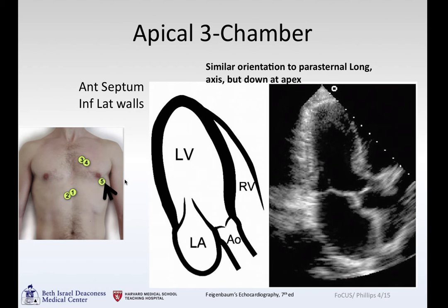Rotating even further — all of this, by the way, is done with the patient in the left lateral decubitus; you are simply rotating the probe — you can bring out the apical three-chamber view: left ventricle, left atrium, aortic valve, and mitral valve. This should ring a bell as similar to the parasternal long axis. It's basically the same thing, just from a different orientation. Instead of being up at spot three, you're down at spot five at the apex, so the apex is what you see first, but it's all the same walls.